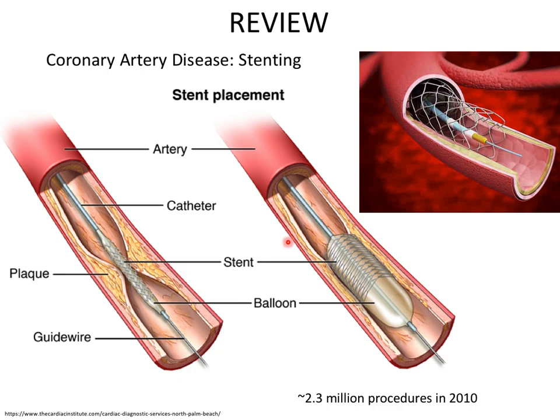The other risk is that you cause a tear in the vessel or some damage such that it restenoses very quickly. The other risk is if this is really tight, getting the guide wire across is not easy.